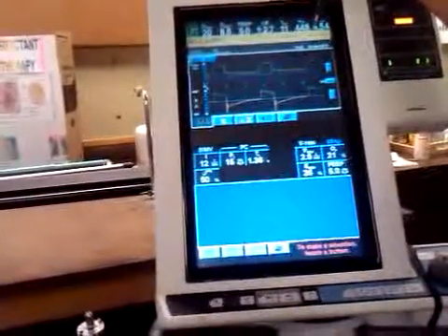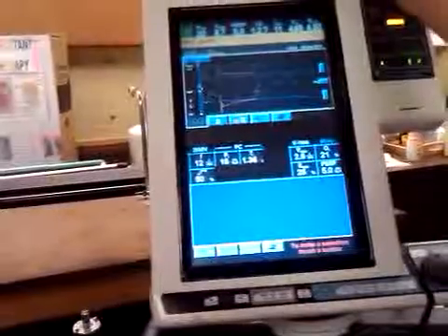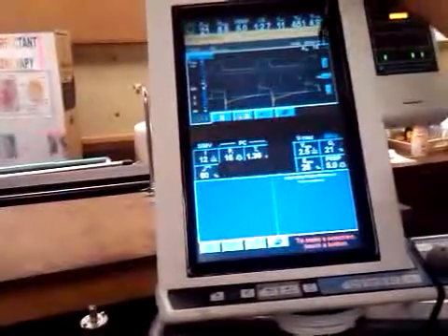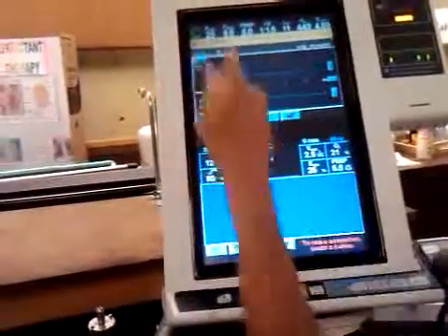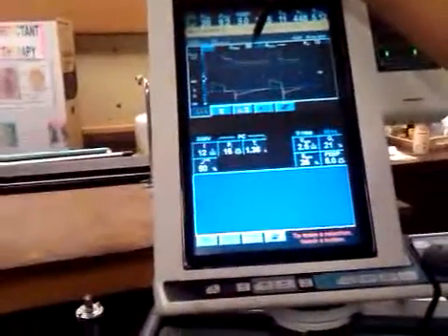So on SIMV, you're going to do the same thing. You're going to get your minute volume divided by your frequency, so 4.67 divided by 11, to get your tidal volume. You're going to hit the inspiratory pause. You're going to get 20 and 13, P1 and P2. We could do it again. Hit inspiratory pause. 20 and 13. And you're going to have your static compliance calculated for you, but ignore that.